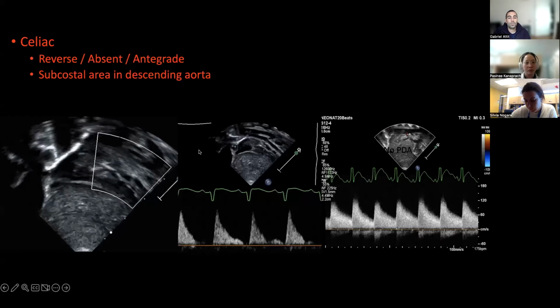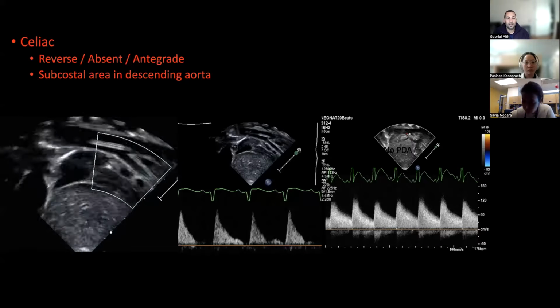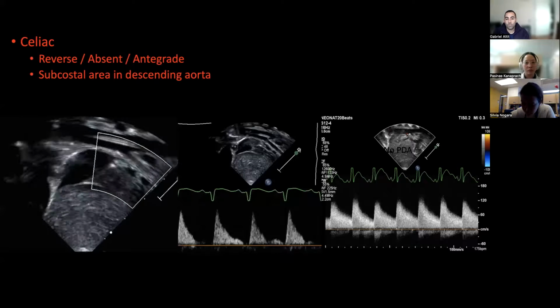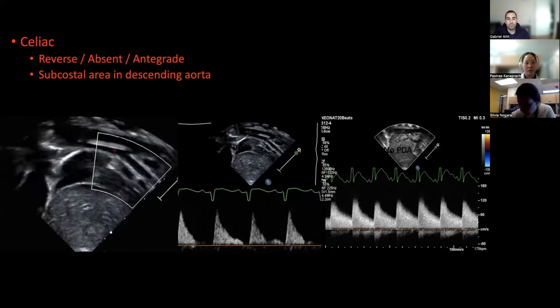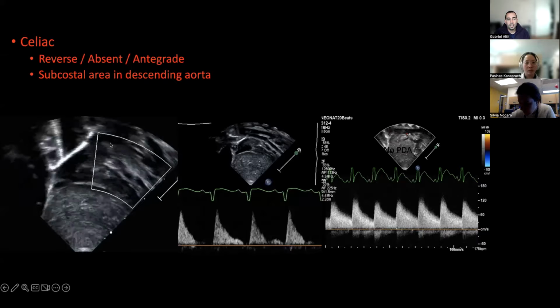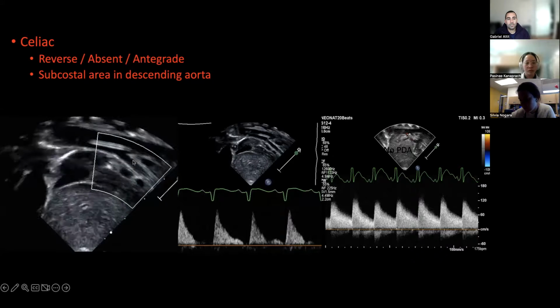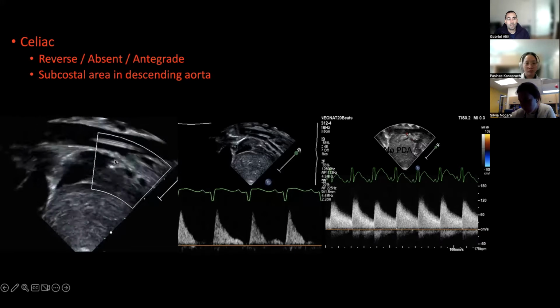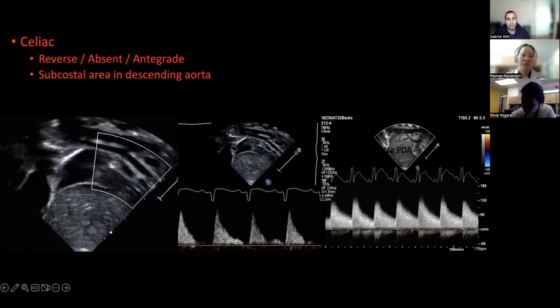So some of the things we'll look at in a left or right PDA shunt are things like end organ perfusion by ultrasound, so markers of end organ perfusion. This is an example of the descending aorta. We even see an umbilical arterial line floating in it. And we can see two vessels branching from the descending aorta. We have the diaphragm here, which is this white line.